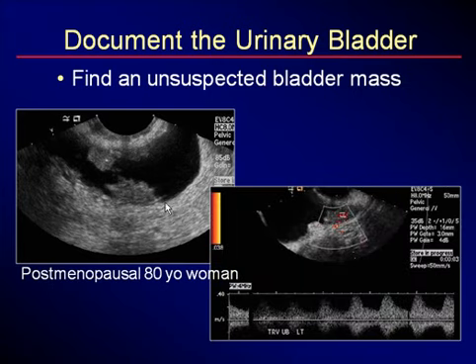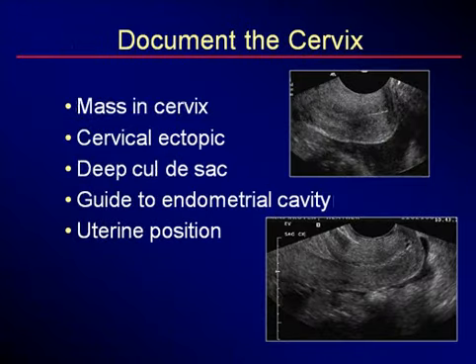Further investigation revealed that these were solid masses, and this woman had 2 transitional cell cancers in her bladder. It actually happened that this was not postmenopausal bleeding. This was actually hematuria. She complained that when she wiped herself with some tissue, she saw blood, and she right away thought it was vaginal spotting. But in fact, this was urine that had blood, hematuria.